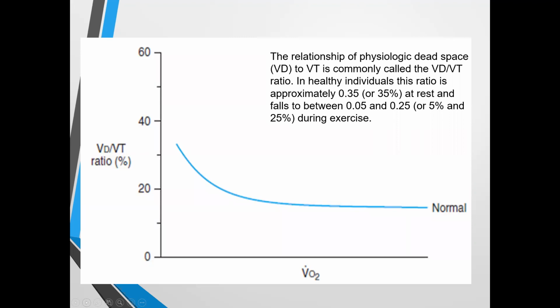Of the ventilation, I would say, is wasted, but it's dead space. So it's not participating in gas exchange. That percentage falls pretty demonstrably, owing mainly to the minute ventilation and the tidal volume going up. So you're seeing in this graphic that the dead space drops as the oxygen uptake actually increases, as the stress load increases. And what's at play there is the fact that the minute ventilation is increasing at such a rate.